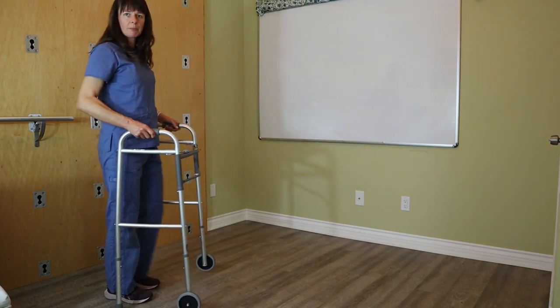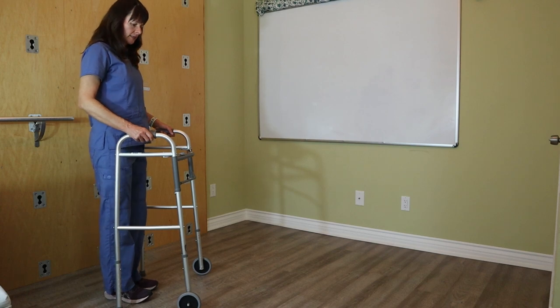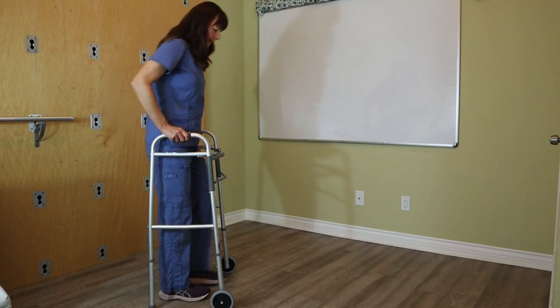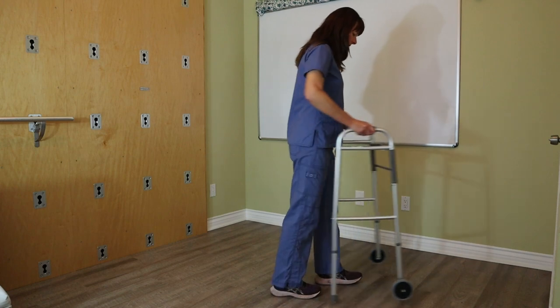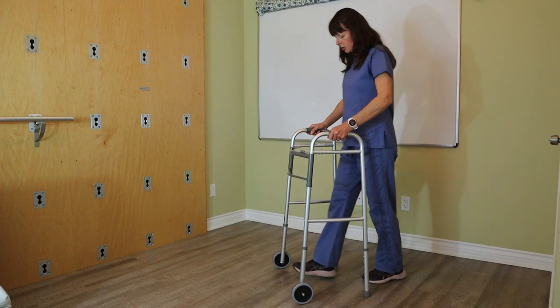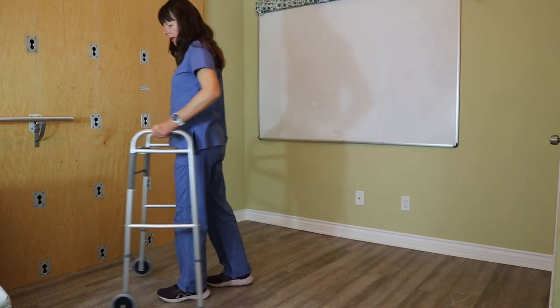If the patient had an injury to one leg — let's say my right leg is injured — I want to move the injured leg forward with the walker, and then bring the good leg through, because the walker always helps support the injured or weaker leg. So: walker, injured leg, then slowly push forward.